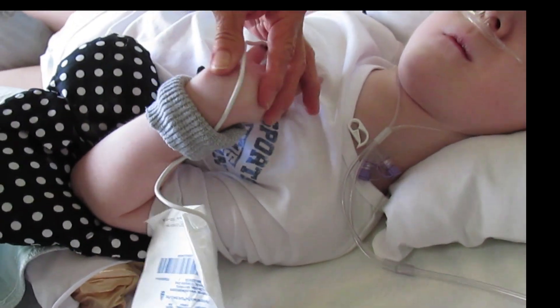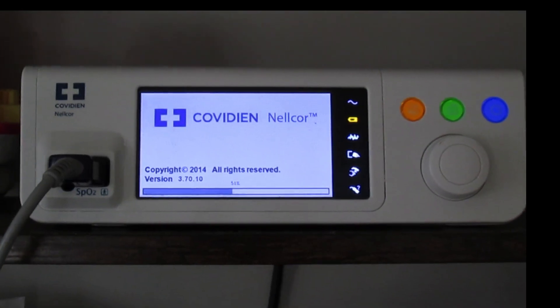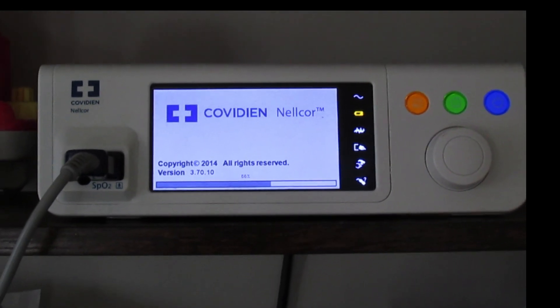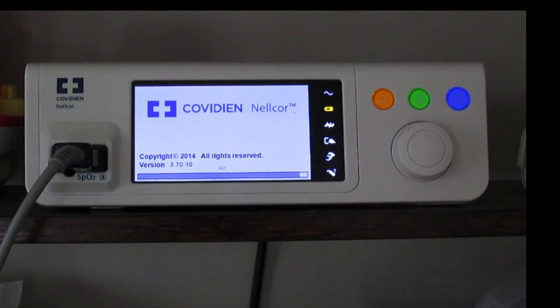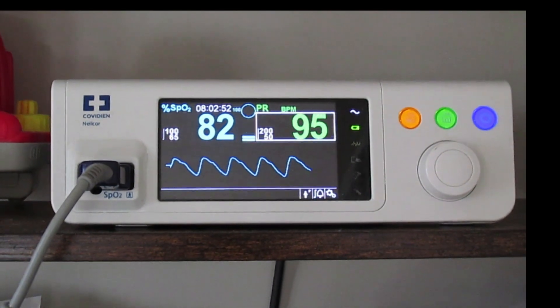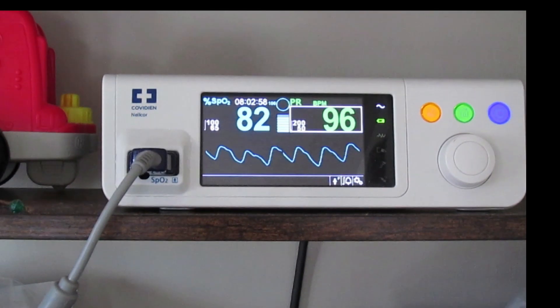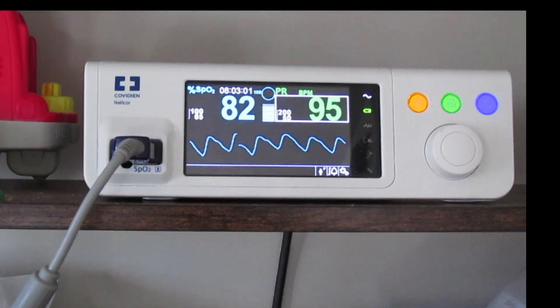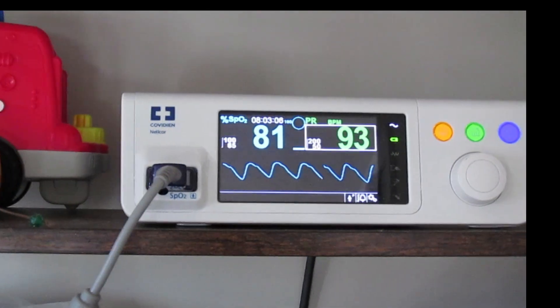Now we'll hook it up to the monitor and turn it on to see if we have success. We got a good pulse waveform. We're showing 82 on his sat, which is normally pretty good, and his heart rate is about 95 because we've been working with him and aggravating him.